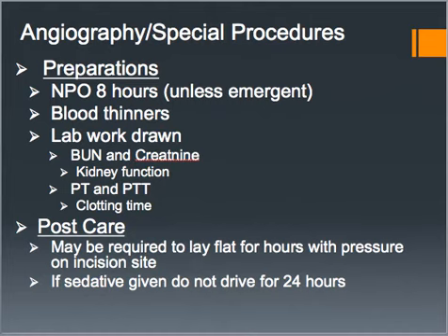After the procedure, the patient's going to need a pressure bandage wherever that incision site is, so either on the wrist or the groin area, to help stop that bleeding. And then the patient's going to need to lie flat if the incision's in the groin, or if it was in their wrist, they don't want them using that wrist or raising their hand up or bending it or doing anything like that. If the patient was given a sedative, which most of them are, they don't want them to drive for 24 hours. So the patient's always going to have to bring a driver with them, and they don't want them to drive for 24 hours after the procedure.